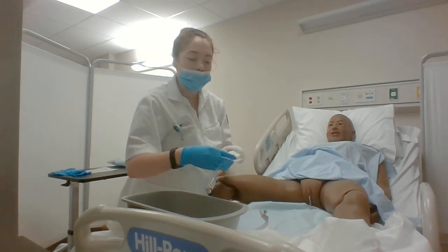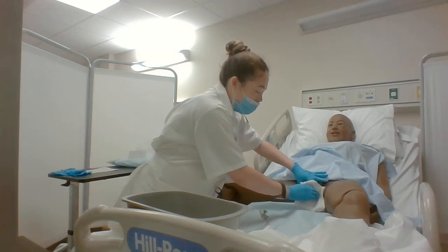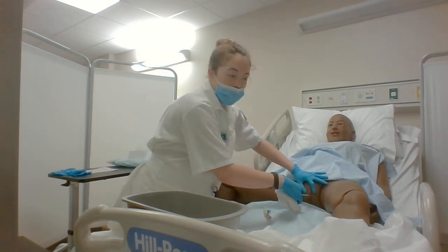Okay, now I'm going to clean the catheter — approximately four inches.